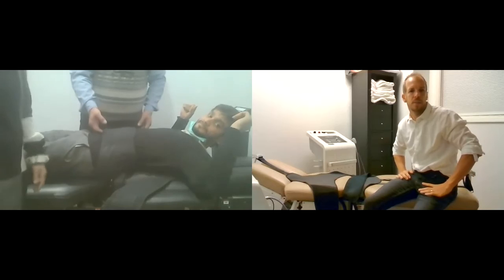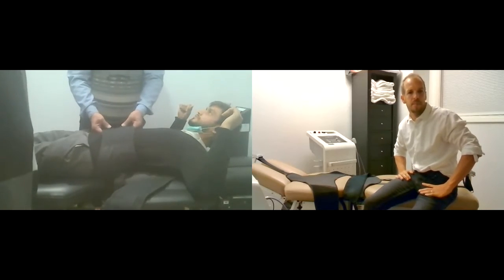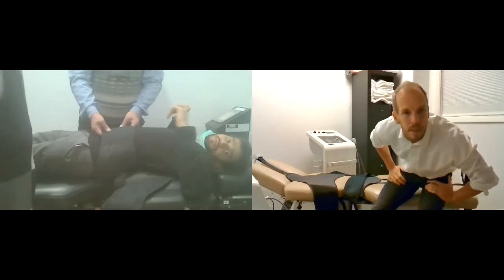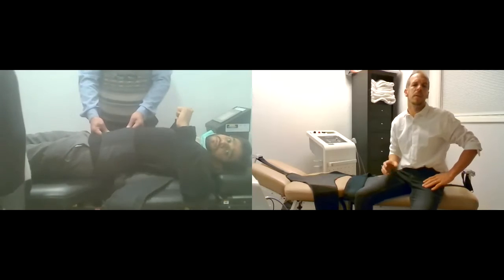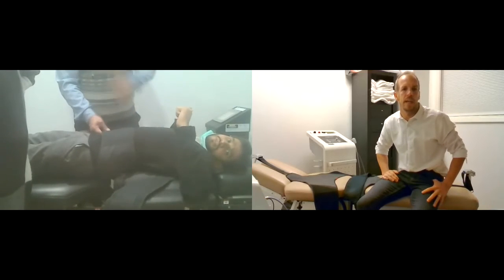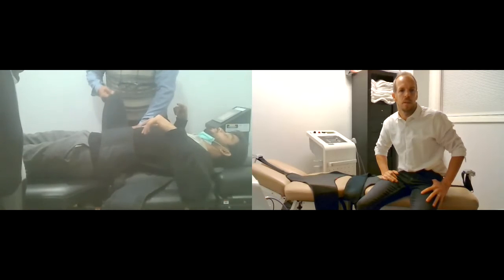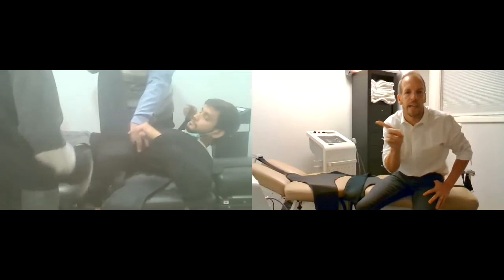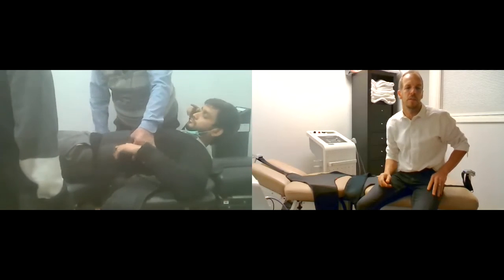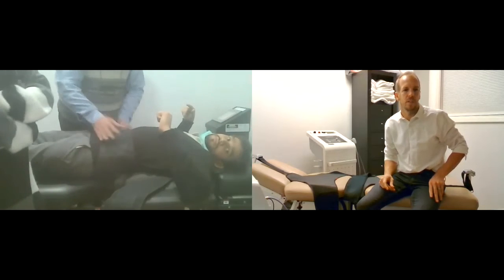I say it should be snug, tight but not too tight. It should not be too tight or too loose. It should be more on the tight side than the loose side. I think just a tiny bit tighter. He needs to slide up just a tiny bit too. That's close enough.